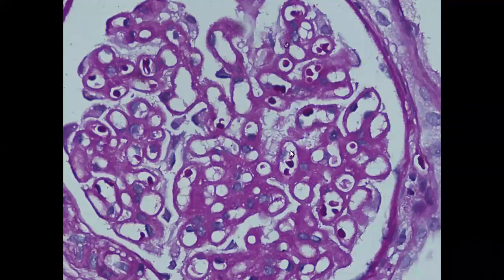The other thing is, you can see these things inside the glomerular capillary loop. Look at this. What are these cells? Inside the glomerular capillary loop, if you find certain inflammatory cells, say these are lymphocytes and possibly an occasional neutrophil, what do we label this as? We label this as endocapillary hypercellularity. So there is endocapillary hypercellularity. Its presence suggests that we are dealing with possibly a secondary kind of membranous, because primary membranous should not show any endocapillary hypercellularity.